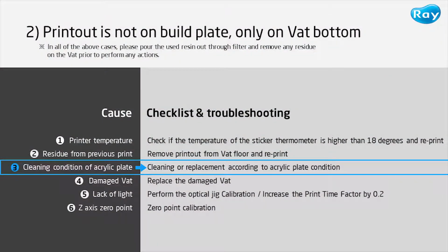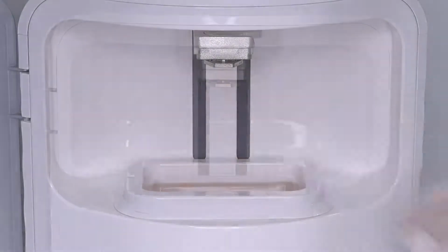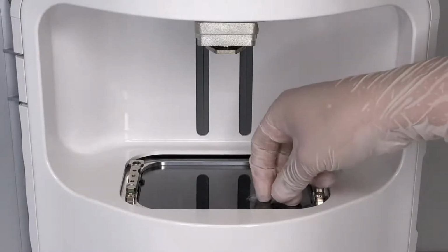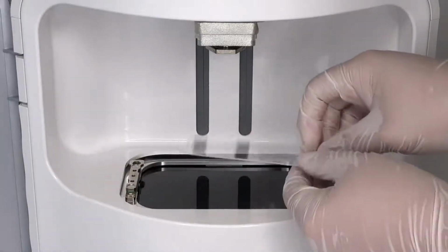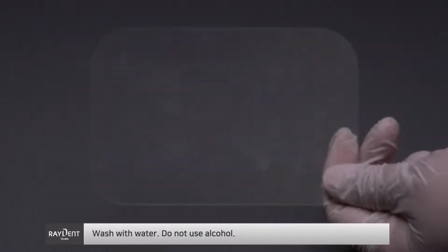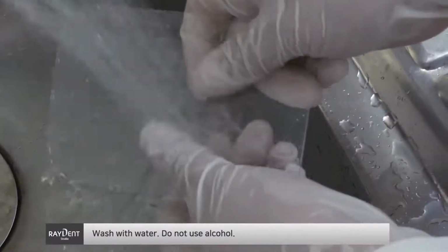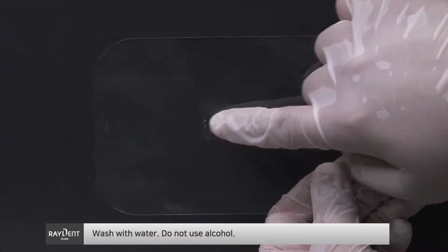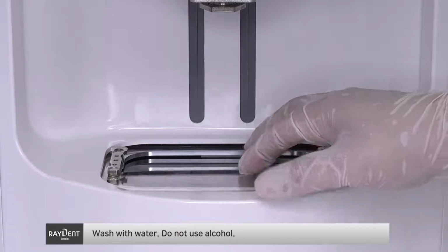The third cause is the clean condition of the acrylic. After removing the VAT from the chamber, remove the acrylic plate with regular adhesive tape and check for contamination. If it is possible to clean with water, wash it and reuse it. If it's not possible, replace it with a new acrylic plate.